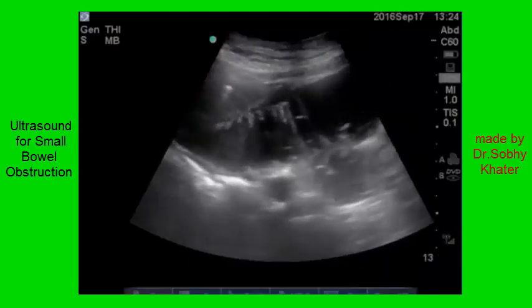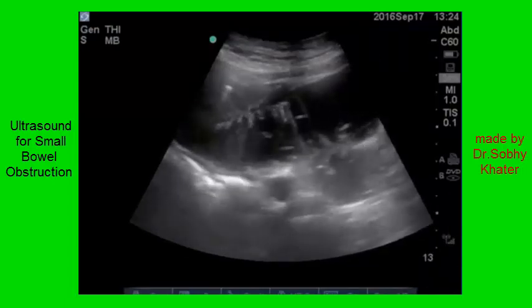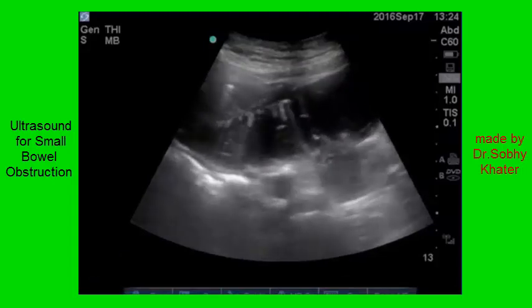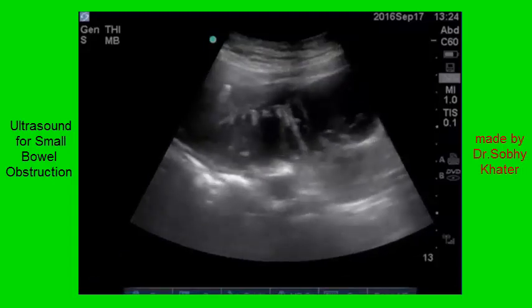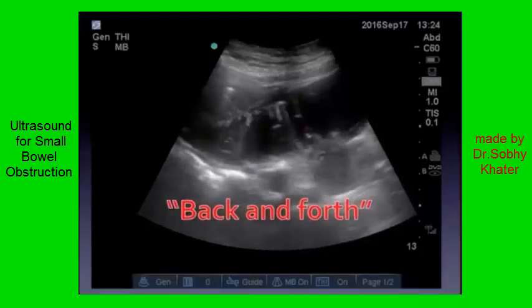We saw this earlier. This is a nicer clip. What I want you to notice here is the motion of the bowel — yes, it's distended, yes it's abnormal — but look at that echogenic material just kind of sliding back and forth without any real peristalsis. This is that absence of peristalsis we talked about earlier, that back-and-forth motion. And this is a sign of small bowel obstruction.